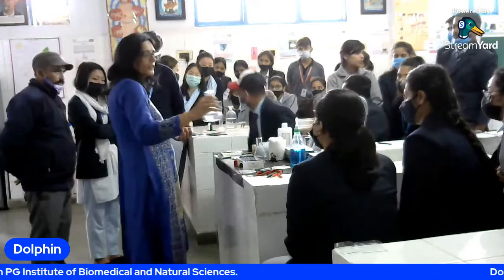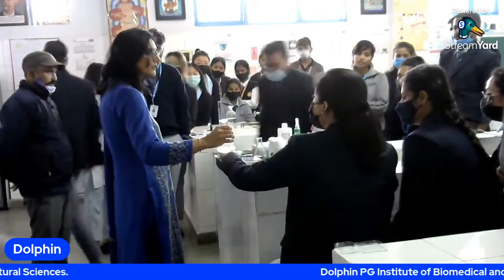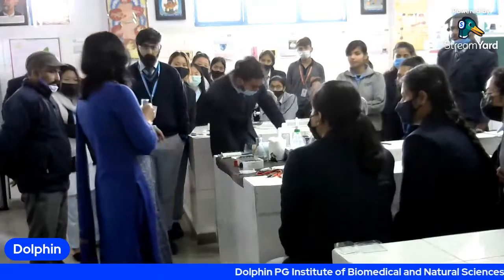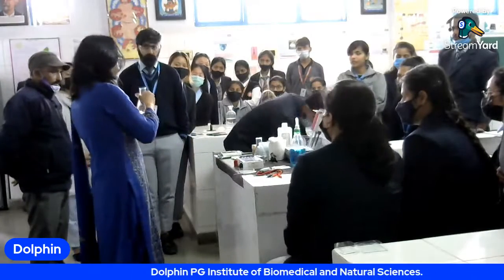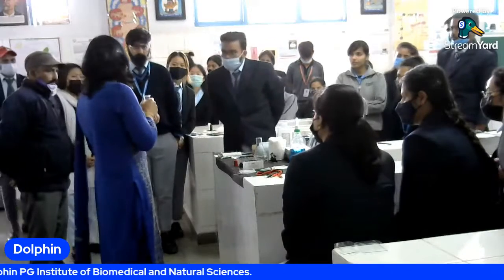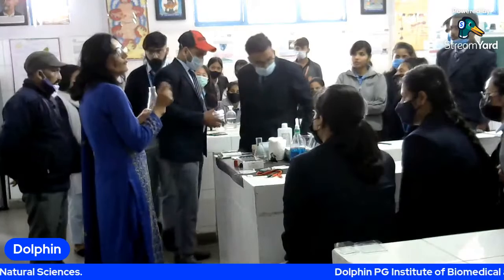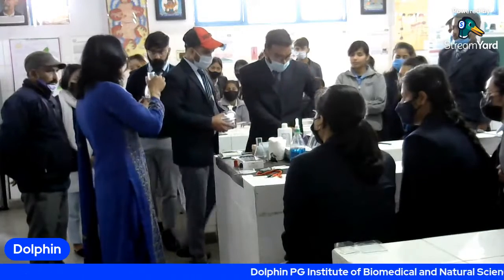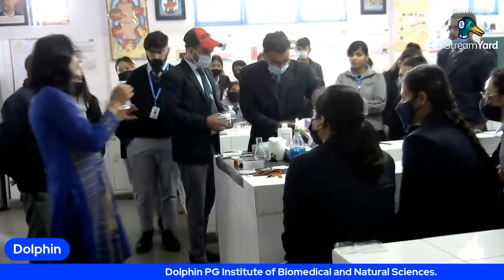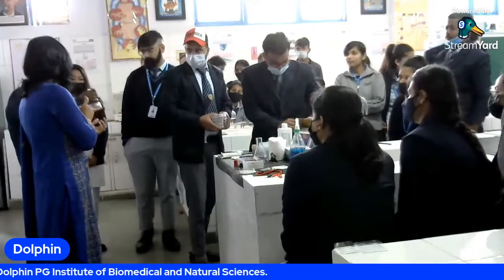Now feel the temperature, feel it like this. How is it? Bearable, okay. I think while we add the antiserum to it, it may get solidified. So I'm giving it just microwaving of 10 seconds so that it becomes a bit warmer and we can add the antiserum. So that's just the second step.